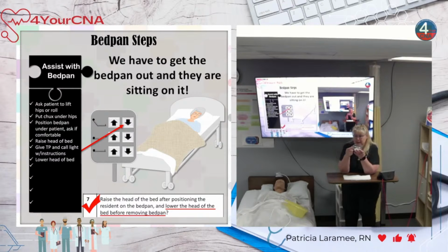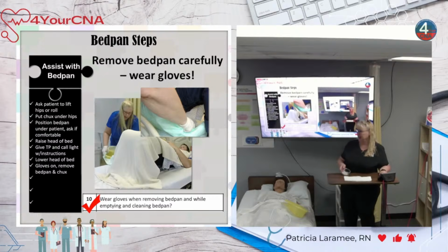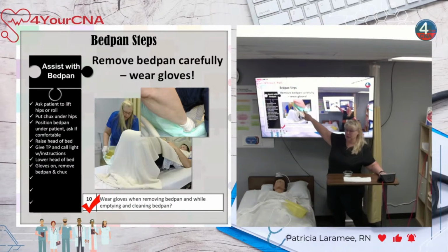Whatever's in this bedpan is nobody's business. We don't want to take an empty or a full container of body waste uncovered through a patient area. That's an invasion of privacy. Nobody needs to see this. So when I take this bedpan out, I take the chucks with it all at once. So the bedpan and the chucks all at once out from under the patient.